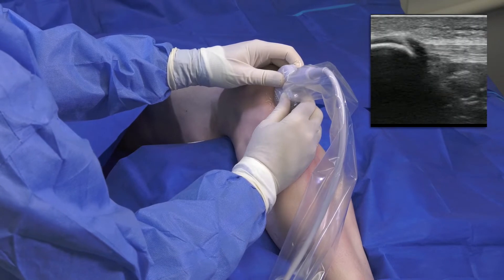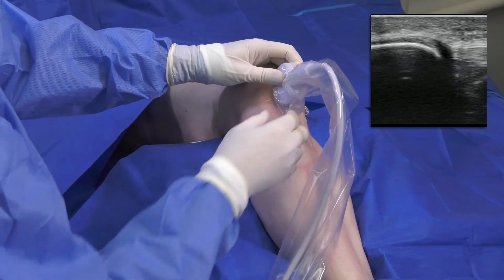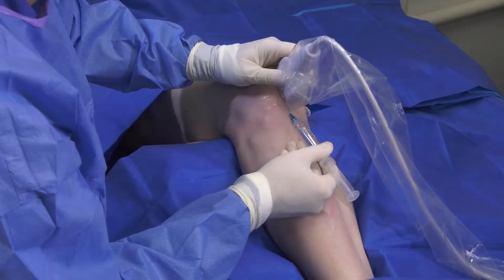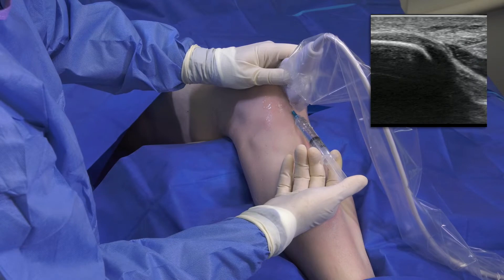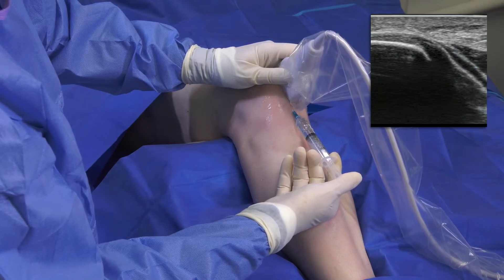Given that the diseased tissue is typically near the origin, I approach from distal to proximal in an orientation parallel to the tendon fibers for best visualization. To ensure that the patient has minimal discomfort during the procedure, I administer a local anesthetic — typically 10 to 15 cc's of lidocaine without epinephrine — creating a skin wheal at the puncture site.